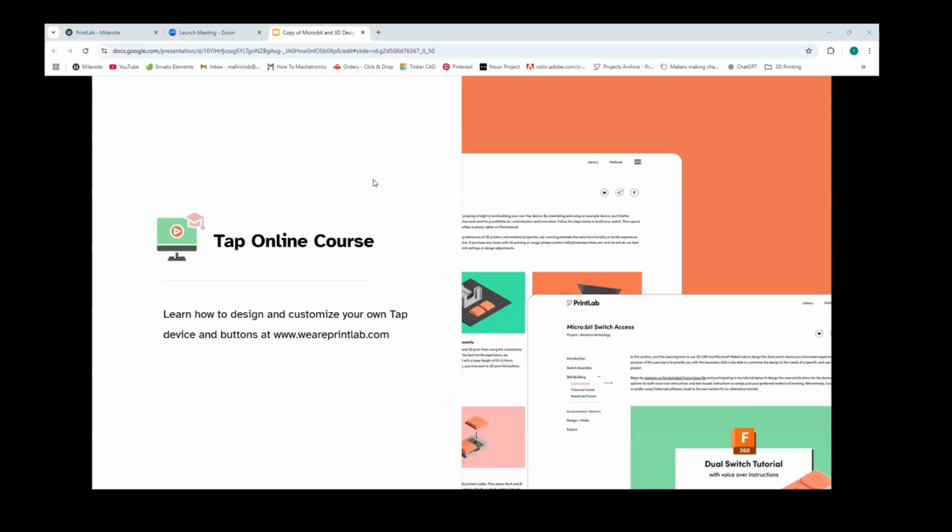So yeah, I hope you've enjoyed learning about the design process of TAP. If you're interested more in the 3D design side of things, we have an online course that guides you through the whole process of designing the TAP from scratch, showing how we did that in Fusion 360. And the idea of the course isn't that you just learn the 3D design side of things. It also will let you identify an end user for your own project and design a custom version of the tap that specifically fits their needs.